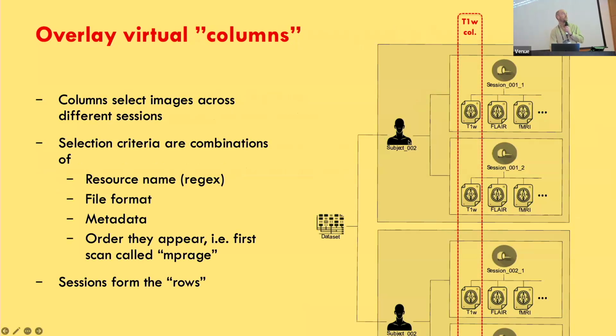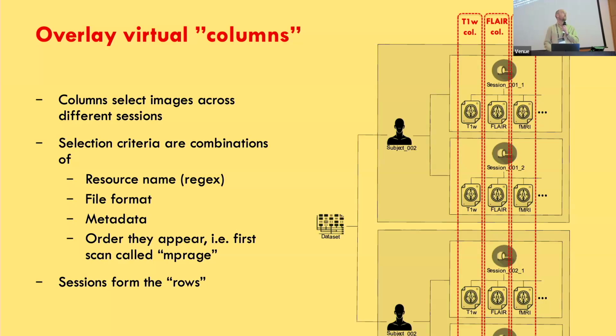So here you can pick up the T1 weighted MRI image across each session, and consider that like a regular expression of the resource name.